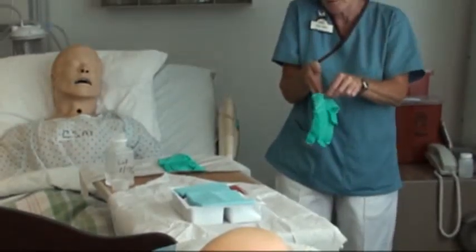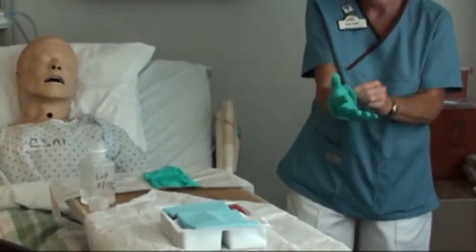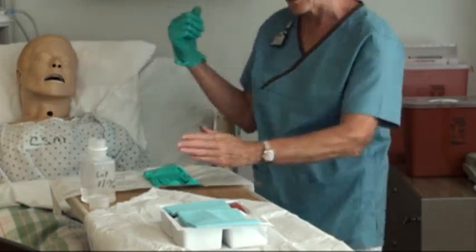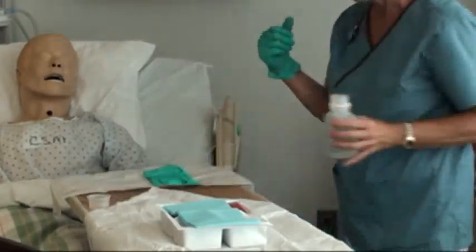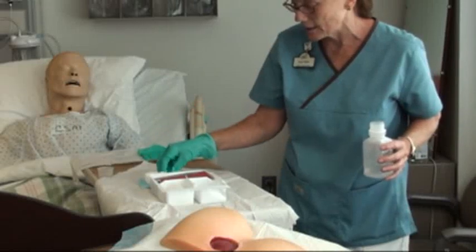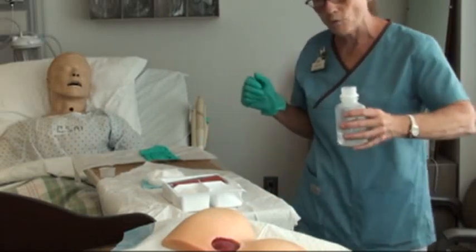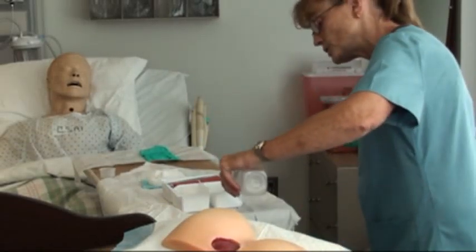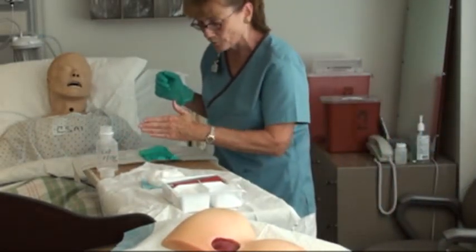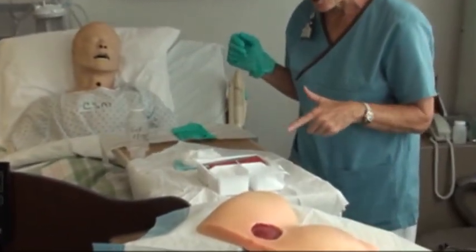I'm right-handed, so I'm going to take my right-hand glove and put it on. Before I do anything else, I want to reach over and go straight down the alley to get my saline, because I need to use my sterile hand to remove stuff from one of the compartments. I'm going to pour the solution in there and move it to the edge so I'm not reaching way over the field with my arm. Come back down the alley — not over the field. That's ready to go now.